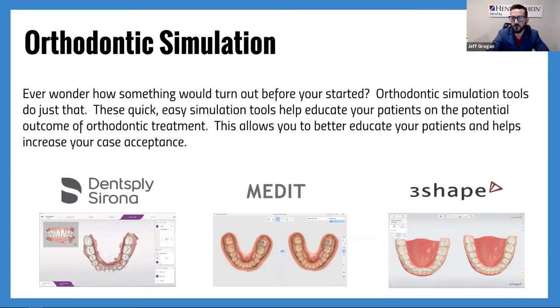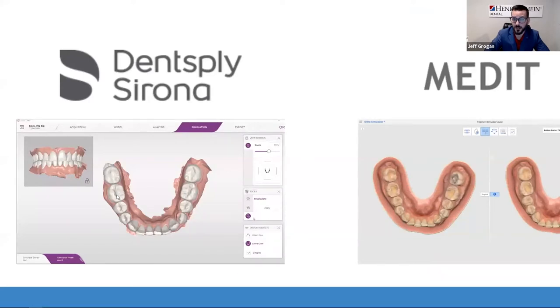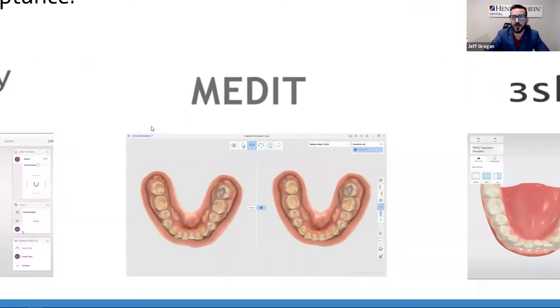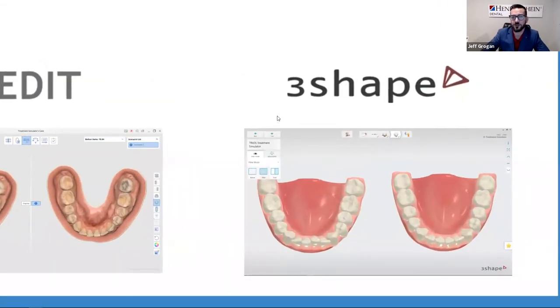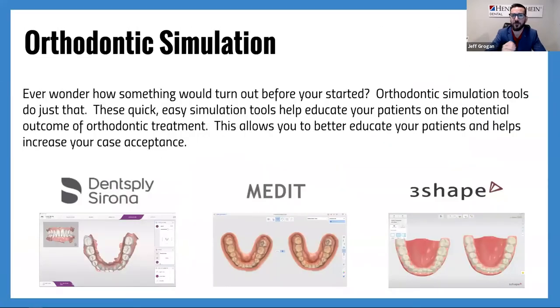To give a snapshot of what some of these tools do, I ran the same case through Dentsply Sirona's orthodontic tools, Medit's ortho simulation, and 3Shape's treatment simulator. All three have a lot of the same principles but operate slightly differently. Both Sirona and Medit incorporate analytics — segmenting tooth from tooth, tooth from tissue — and provide reporting alongside that ortho simulation. 3Shape is a very instant-gratification, quick, easy ortho simulator for doing something very quickly chairside.